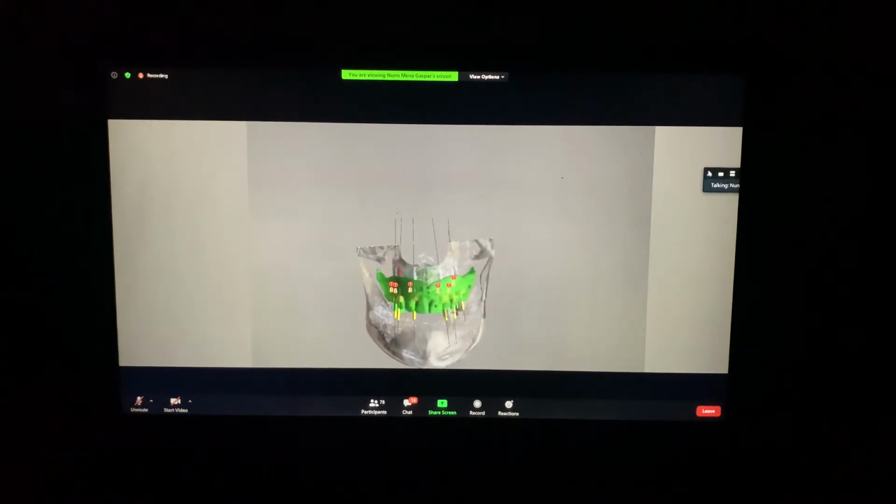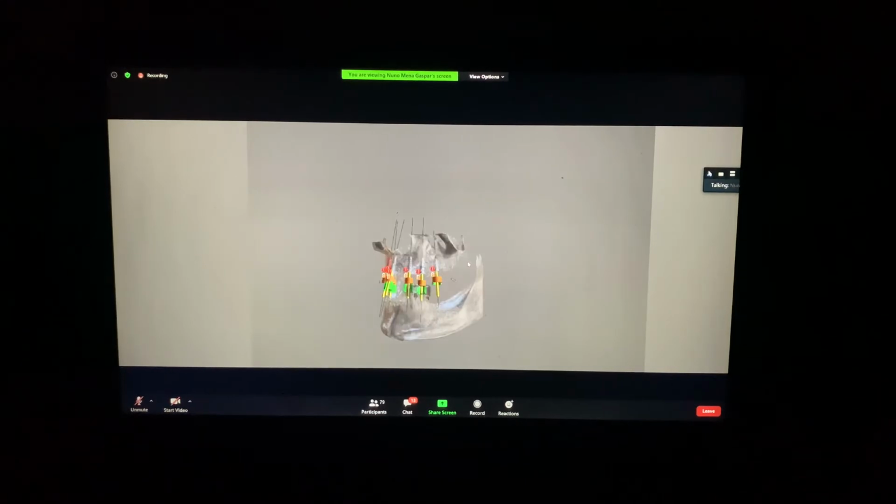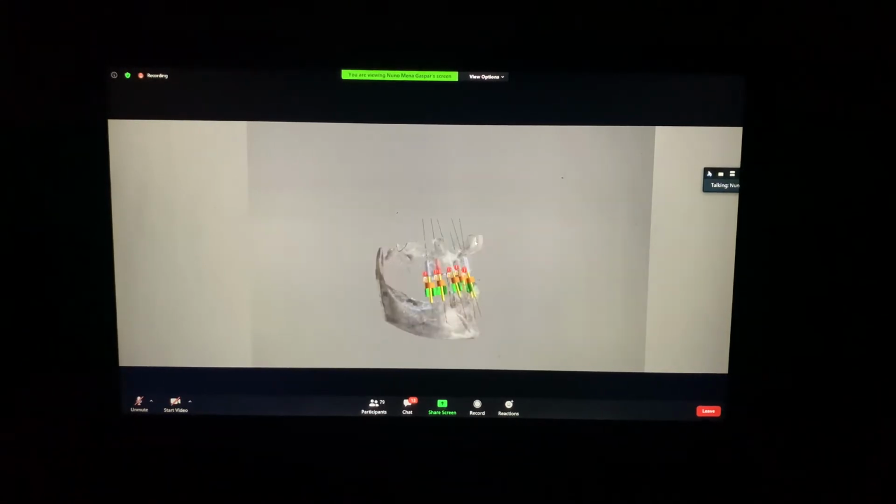Okay, so everything is based like a denture on incisal edge position, mid facial line, and occlusal plane, and the rest is on your technician.